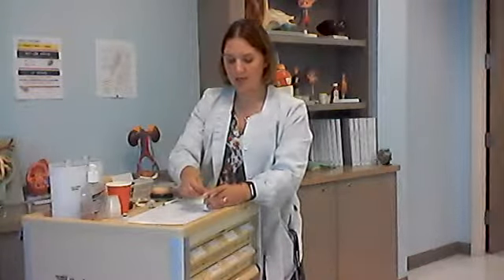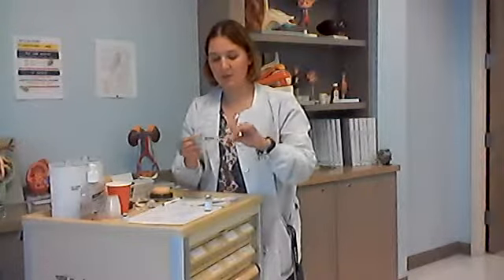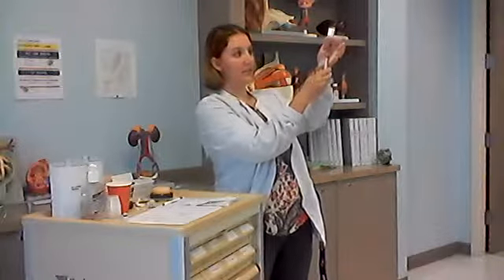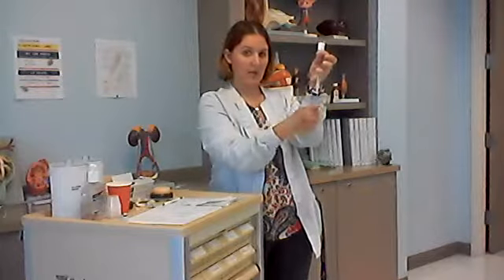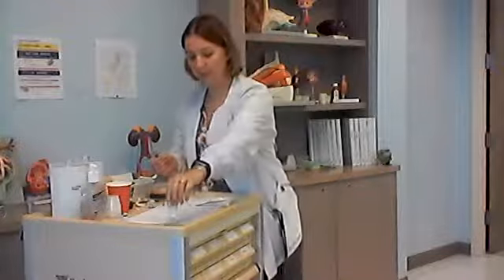Okay. Next, I'm going to prepare my hydralazine. I'm going to clean the top of my bottle, and I know I need 0.5. So I'm going to draw that up in my syringe. I'm going to inject my air. Now, because this is a long needle, you might have to pull it down a little bit in order to get the solution into the syringe. Again, I flick mine to get my air out and draw it past and push the air out. Whatever method's going to work for you.